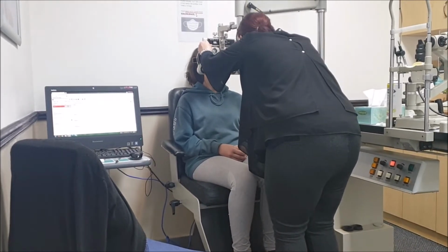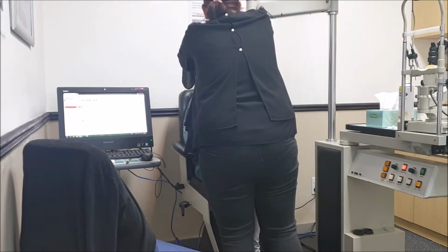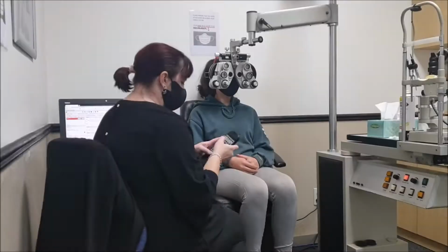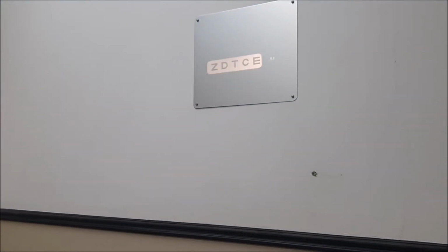And for this, she moved that massive gray thing in front of my face. It's attached to an arm, so she kind of just swung it in. She told me to just sit comfortably, and then she put it right in front of my face. It gets pretty close. It's really up in your business, the way glasses would be if you were to wear them. So just be aware of that if you're a little wary of having things up close and personal. And then I just had a look through these two little holes at the wall opposite me. She turned on a projector, and then there were letters of different sizes projected opposite me. And then she had me read the different rows and tell her what the letters were.